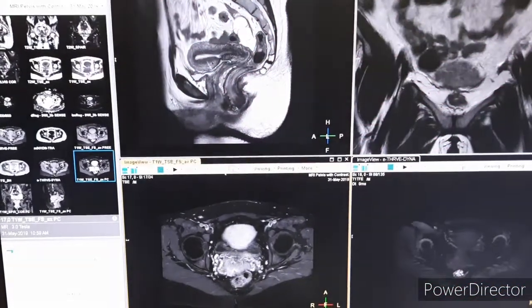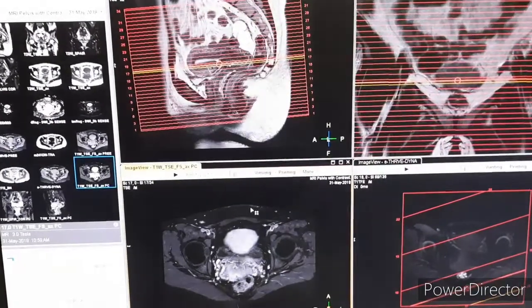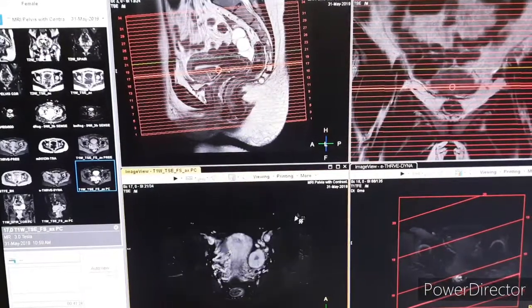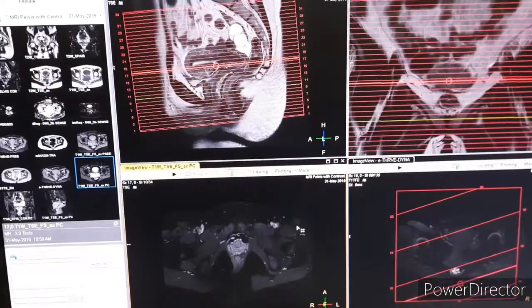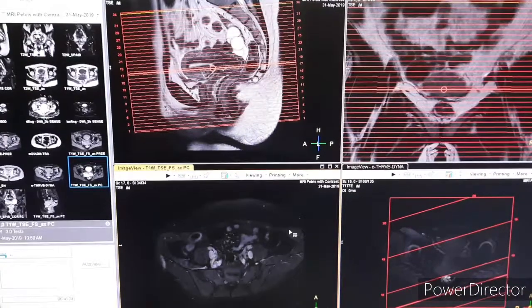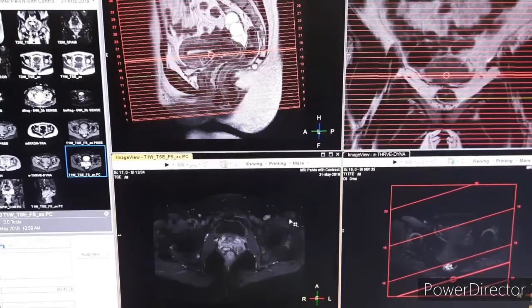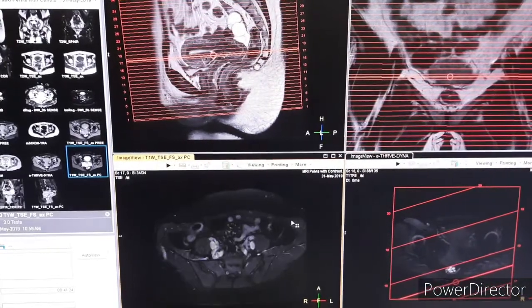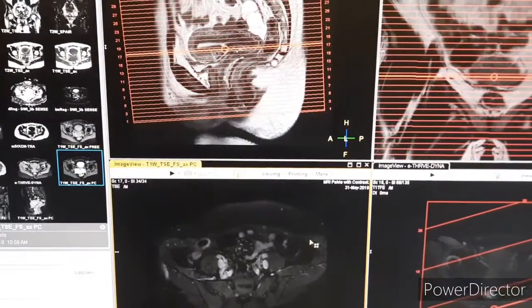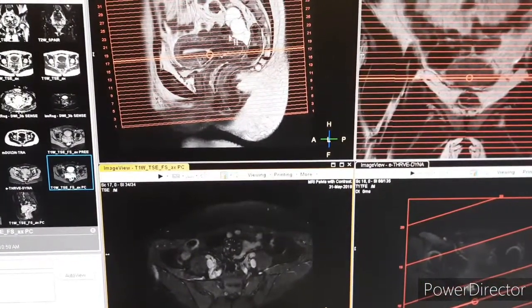For the next sequences, all three planes — axial, coronal, and sagittal — you can keep according to your scan plan. You can see the planning of the axial post-contrast here.